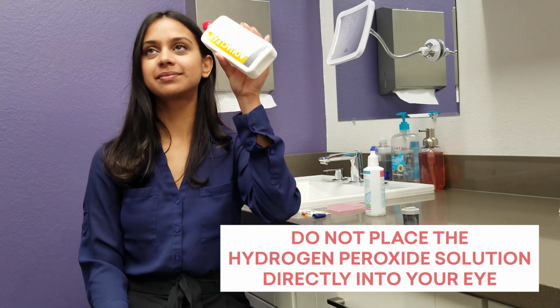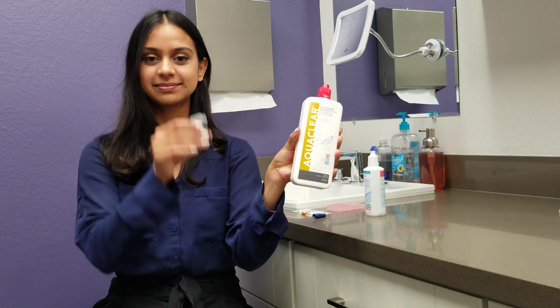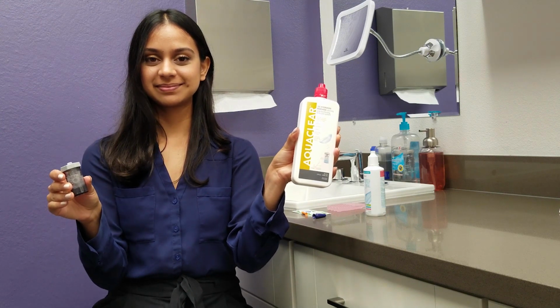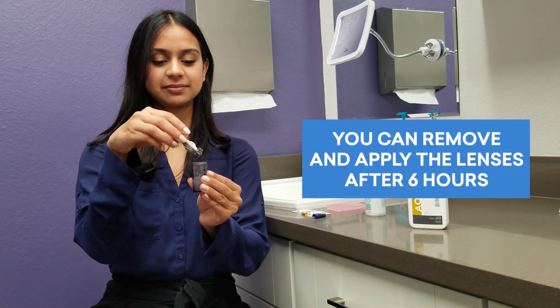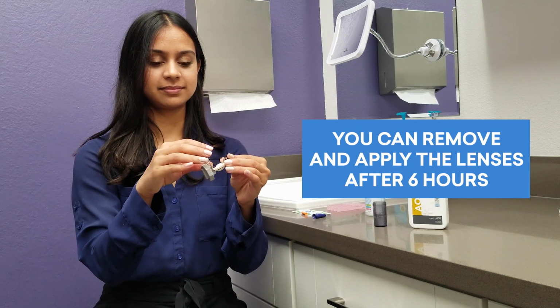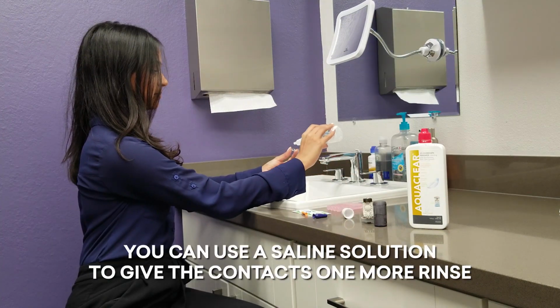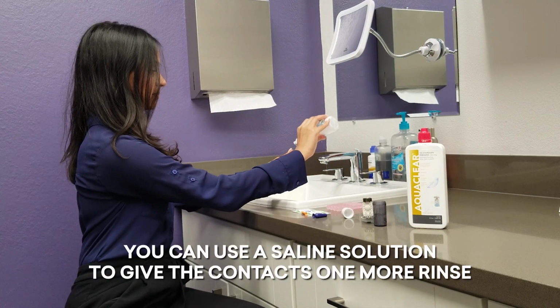Do not place the hydrogen peroxide solution directly into your eye. It should only be used in combination with the provided container. After 6 hours, the contacts are now safe to remove from the basket and can be placed upon the eye. However, if more comfortable, you can also use a multi-purpose saline solution to give it one more rinse.